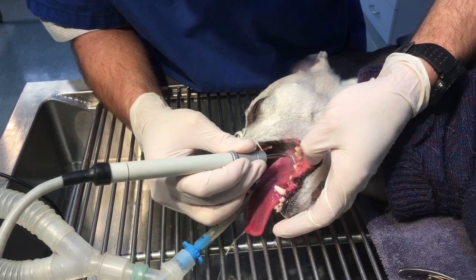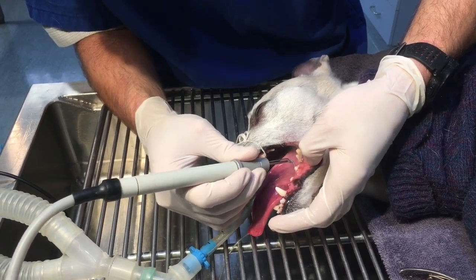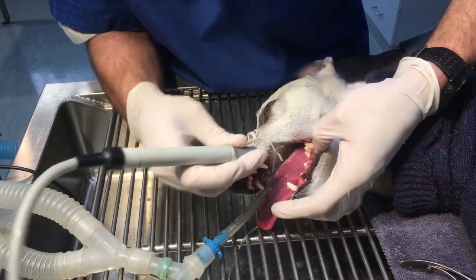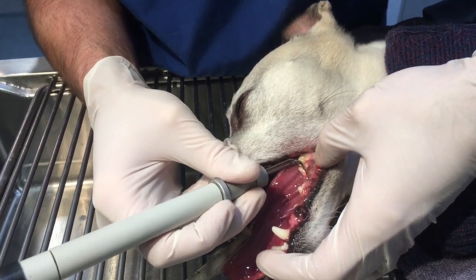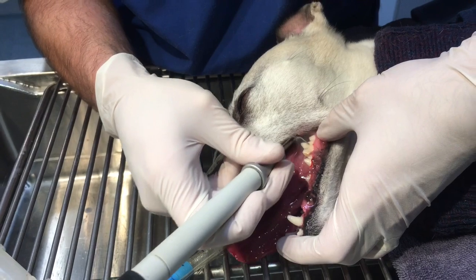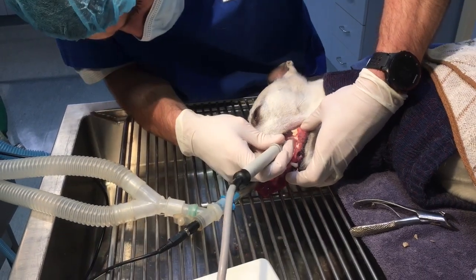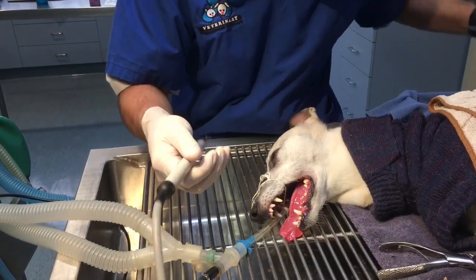My son is a chronic ball thrower, so it's a match made in heaven — apart from for Rosie's teeth. We see it in border collies all the time — flat teeth. They come in and all of their teeth are just flat; you can put a ruler along them. It's fine — it happens gradually, so the body has ways of covering over the pulp cavity. We're getting a little bit of bleeding on this gum — that's just where you've got a little bit of infection from the tartar. We still get in there and clear that out, and the bleeding stops.